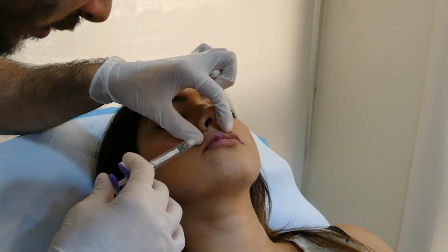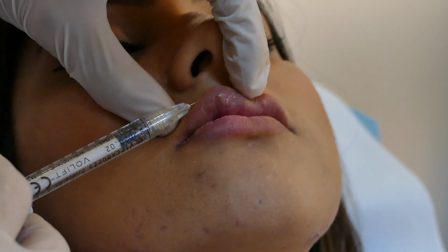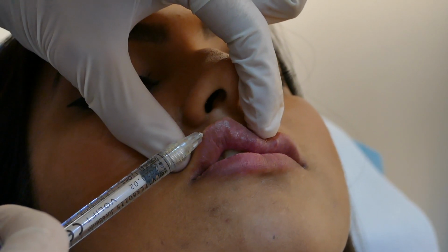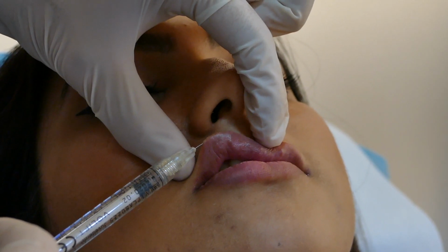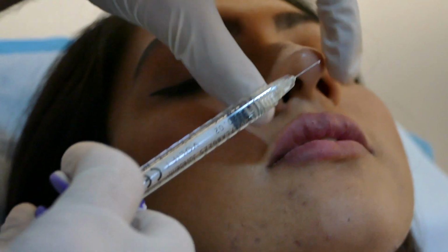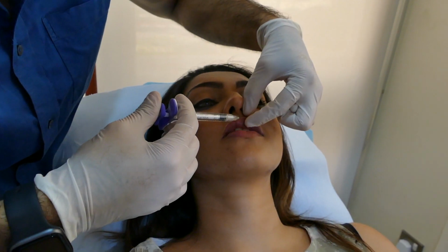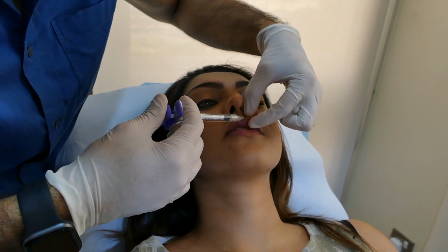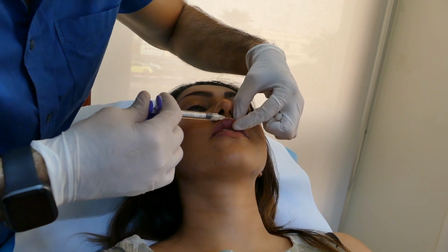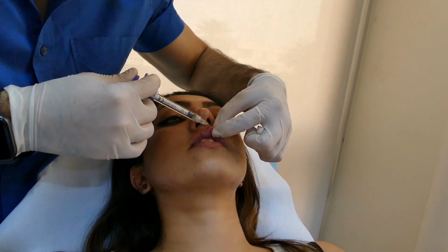The final part of the injection is in the cupid's bow and sometimes in the philtral column to create that M or double bow and double arrow appearance. And this is just into the white roll subcutaneously and a very tiny quantity. It's probably less than 0.1 ml on each side. So that's the cupid's bow injected on both the sides.